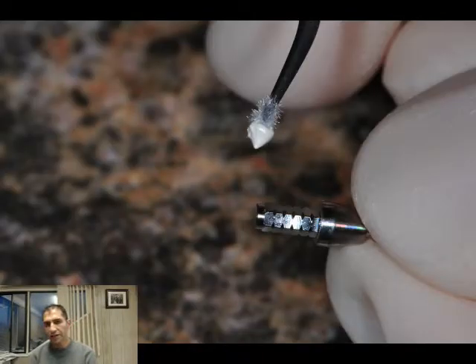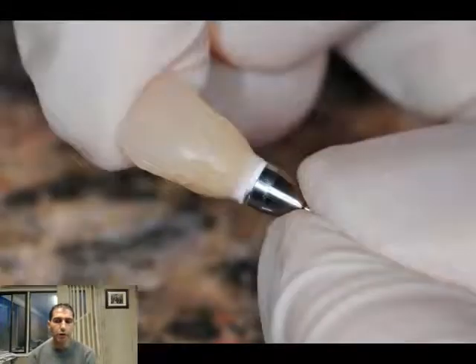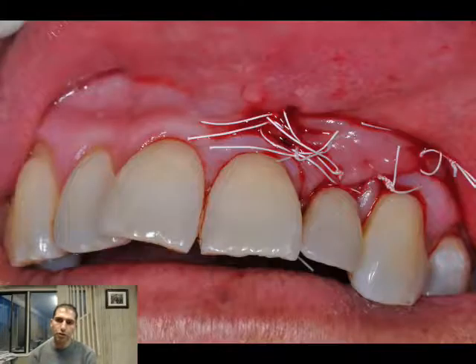We're going to make sure we don't have any cement going underneath, so we're going to use outside cementation with a temporary abutment replica. We'll do the cementation outside the patient, then transfer it after removing any excess cement to the patient.